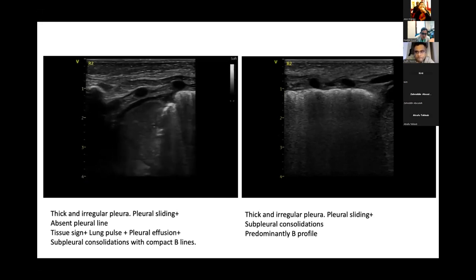And then what I observed was that in the right lung, the severity of the B-line profile was much more than the left side. Because in the beginning, I was thinking this baby has multiple underlying causes of having bad lungs. Of course, it's a preterm baby, but there's the antenatal history, and then there's the fact that you have alprostadil with possibly a very big duct. So in the beginning I thought maybe it was bilateral lung edema related to the large duct, but it's not the same on the other side. No, I agree with you, Nadya, because even on the imaging, the chest x-rays, you find that the changes are always much worse on the right side than on the left. There must be some degree of cardiovascular hemodynamic edema, but it doesn't explain this.